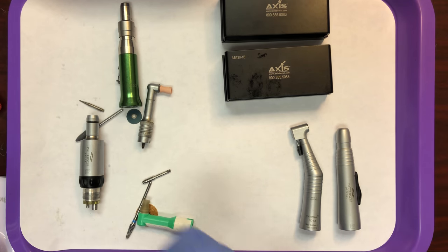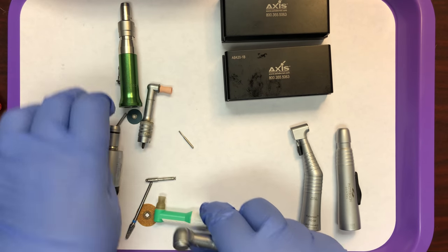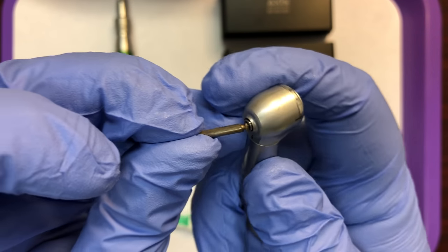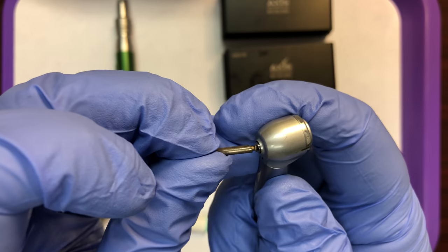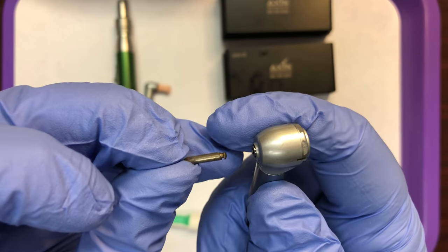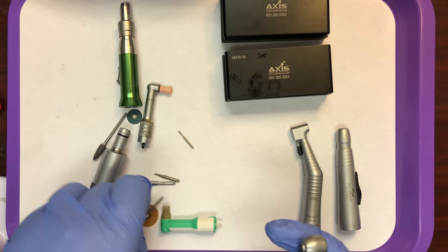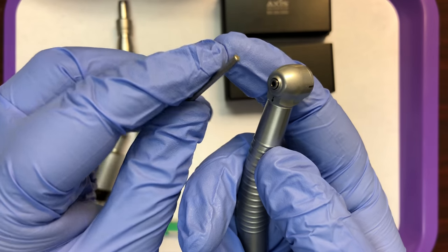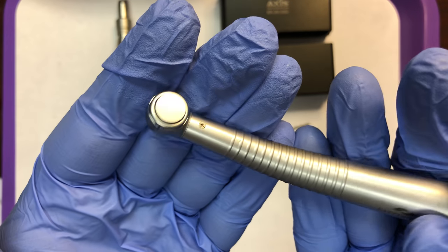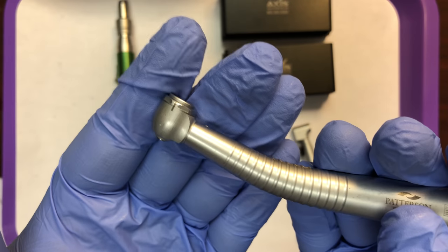Compare this to the latch style — it's just too big; there's no way it's going to fit in here. You just cannot get the friction grip hand piece to hold a latch burr. Same thing with the straight attachment — it's just much too large. Only friction grip will fit into the high speed. That'll help you out when picking the correct style of attachment.